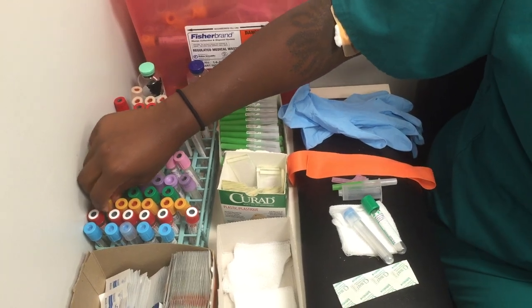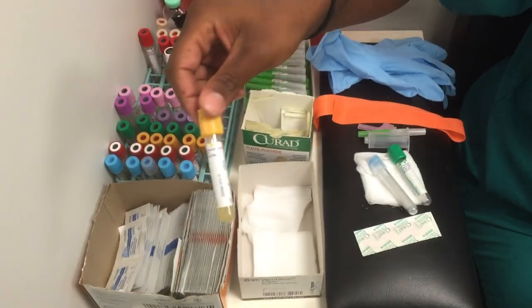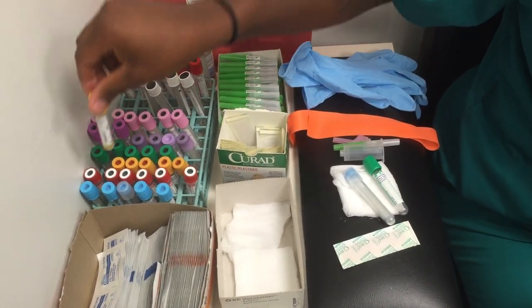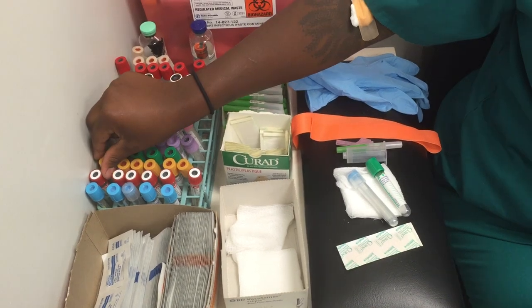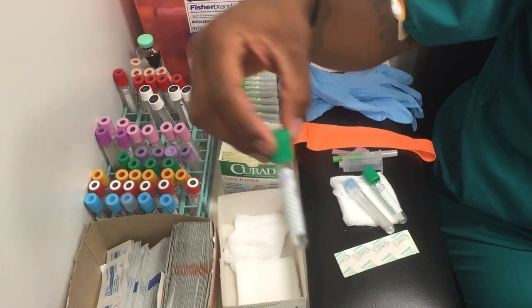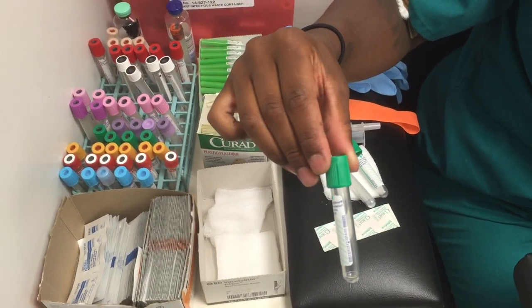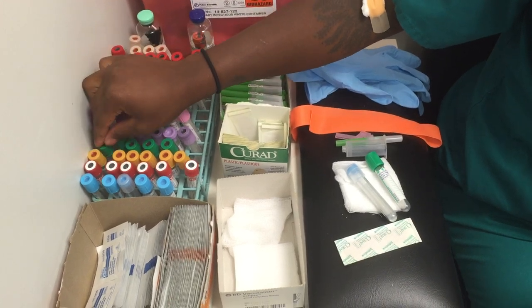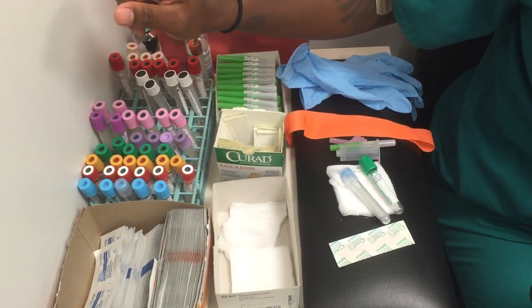Next, we will have a gold top tube. These are SST tubes — serum separator tubes — so they will have the gel in them and clot activators. Next, we have a green top tube. These will inhibit thrombin, so they have heparin in them and they stop clotting.